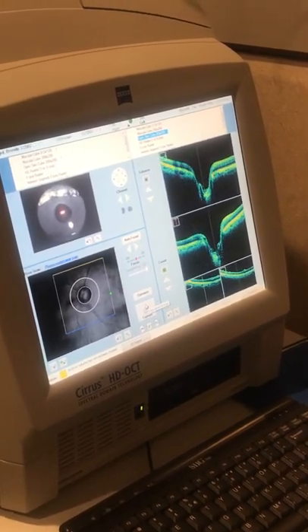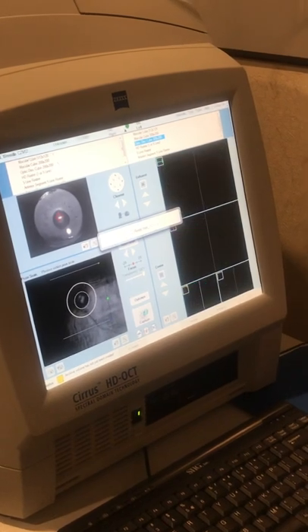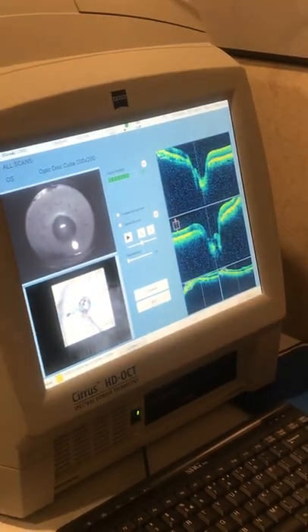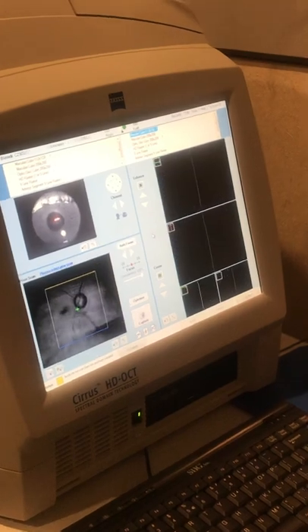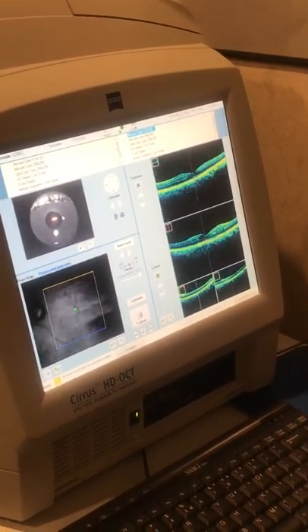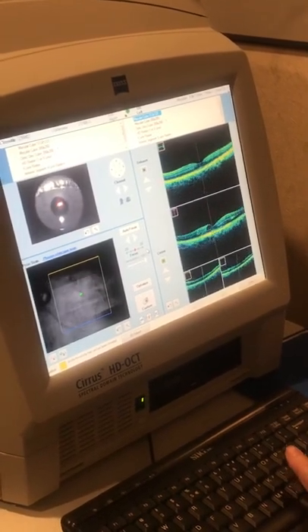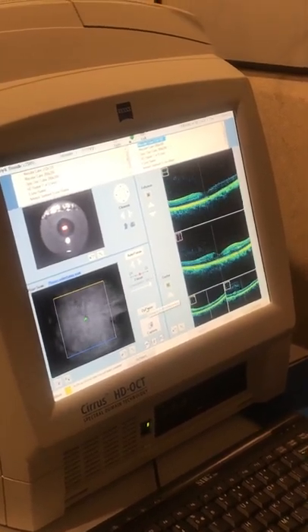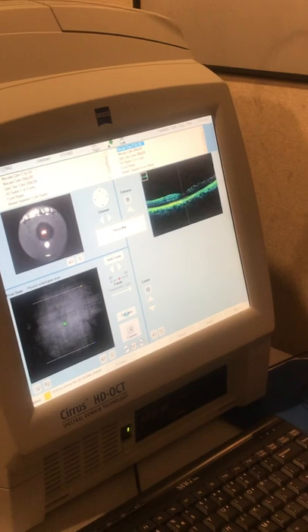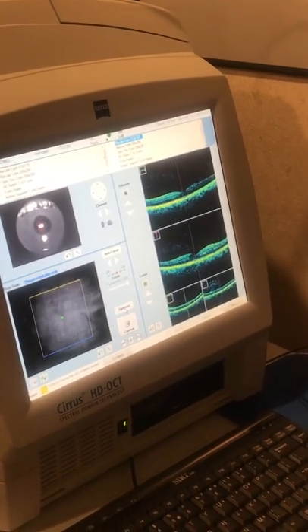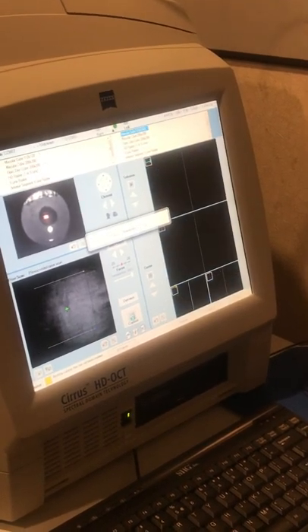Blink a couple of times, open real wide, hold steady — don't blink, don't move. Stay right there. Excellent, we're going to save that. Keep looking at the star — it should move to the center. Look right in the center of that star. We're going to optimize again. We're really close to where we belong, but let's see if the machine can make it just a little bit nicer. Blink a few times — don't blink, don't move, stay right there. Very nice, you can sit back. Good work.